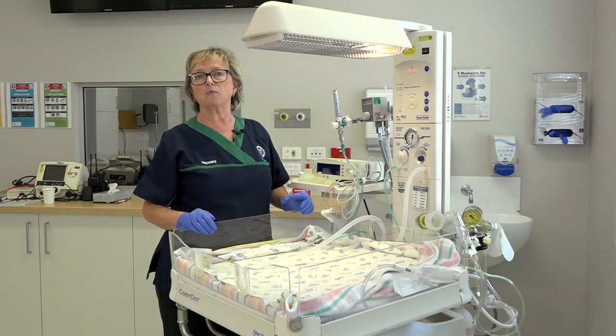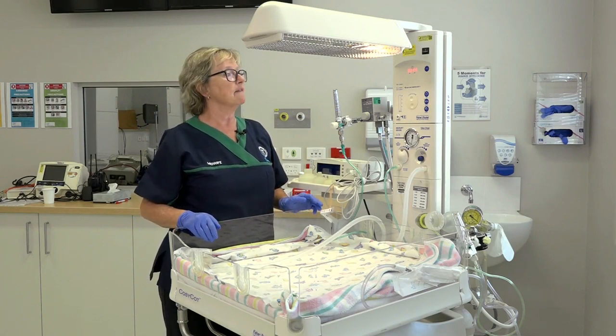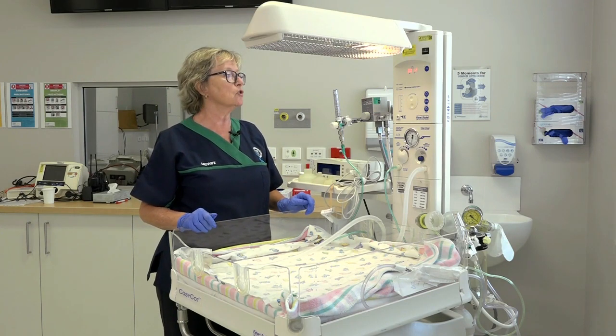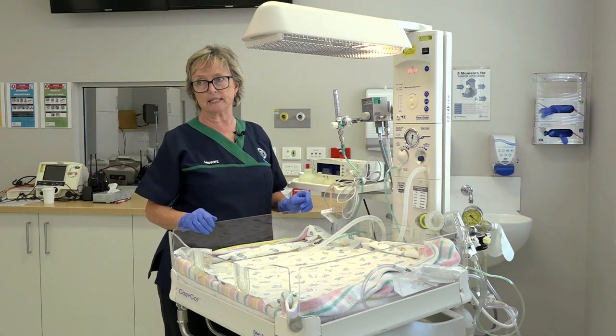You can see the seconds counting up. It will alarm at 1 minute, at 5 minutes, 10 minutes, 15, and so on, for as long as you're continuing the resuscitation.